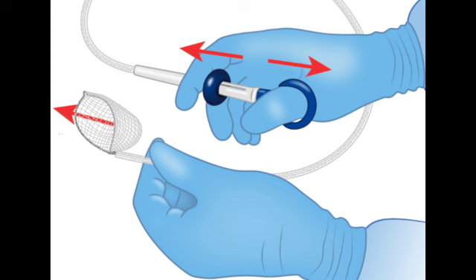So a small polyp may be removed with a cold snare. The first thought, the intuitive thing, must be just suction, right? Suck it up through the biopsy channel. Seems fastest. And that's exactly where you can go wrong if you're not careful. If you just use straight suction, like through the main line, well, that little piece of tissue, which needs to be identified, it just gets sucked right down into the main suction canister.